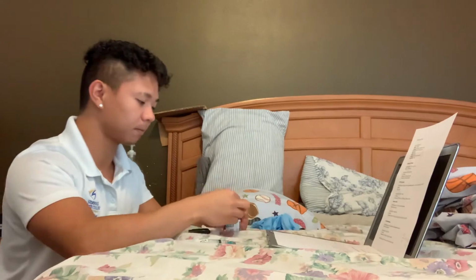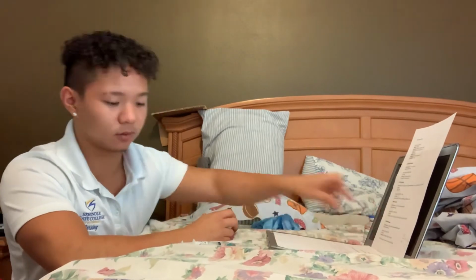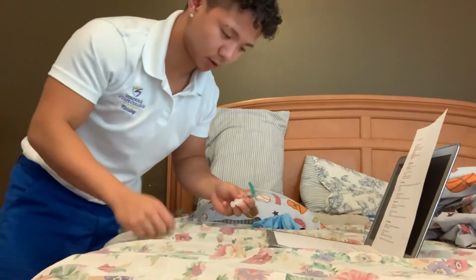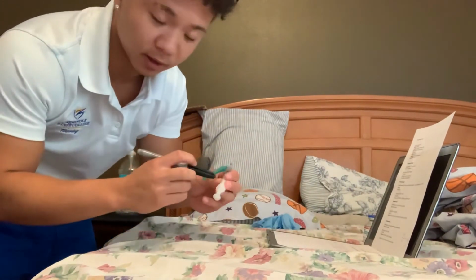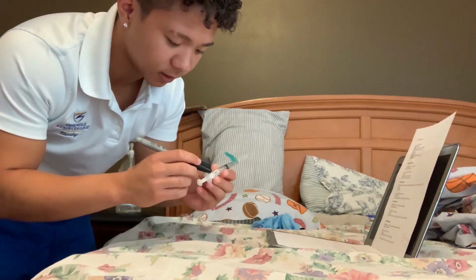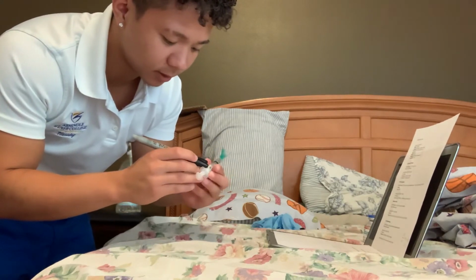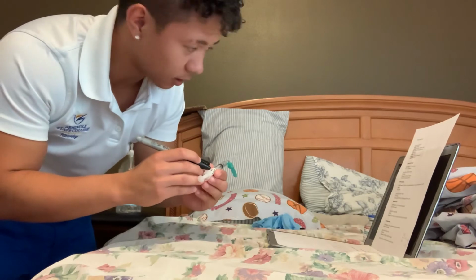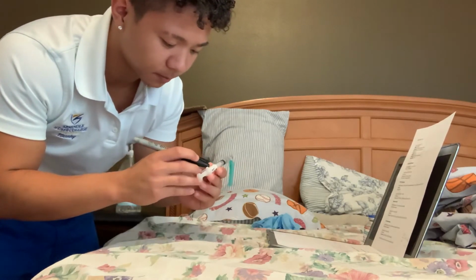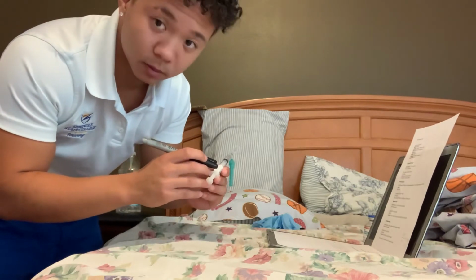And I would label my syringe, put a label with the patient's name, Anna Pawlowski, influenza vaccine, 0.5 milliliters, 14:58, and the date is 6/1/20, and then I'm going to initial AG.